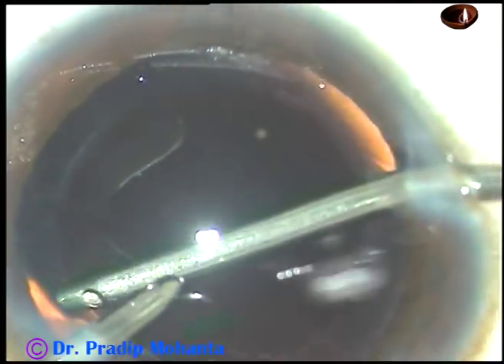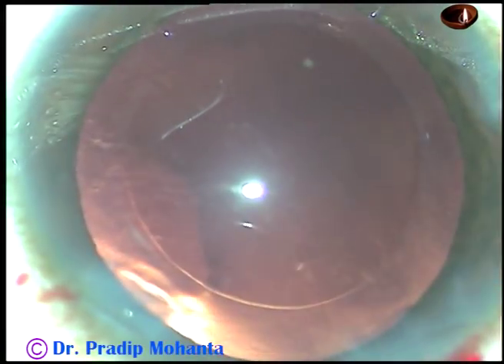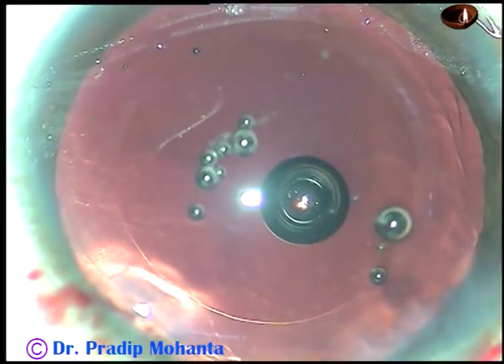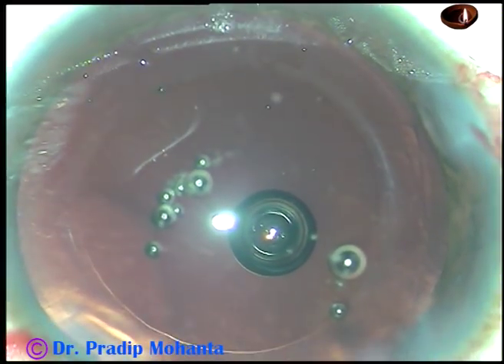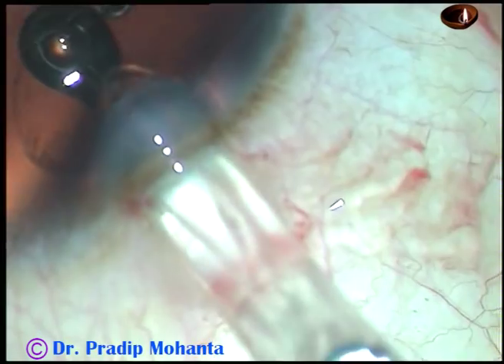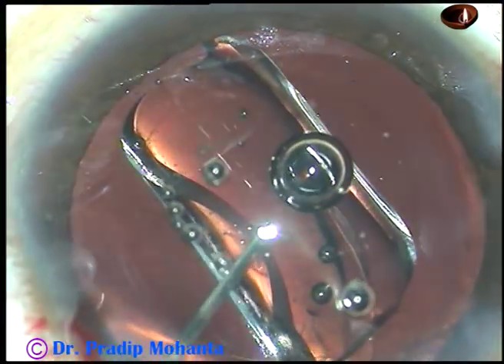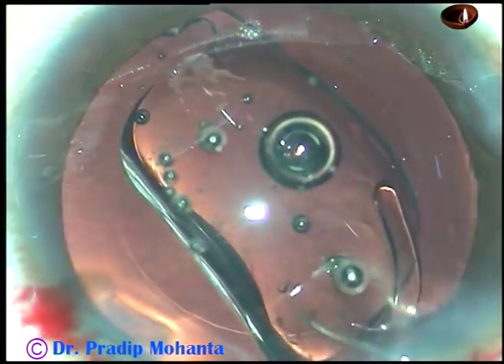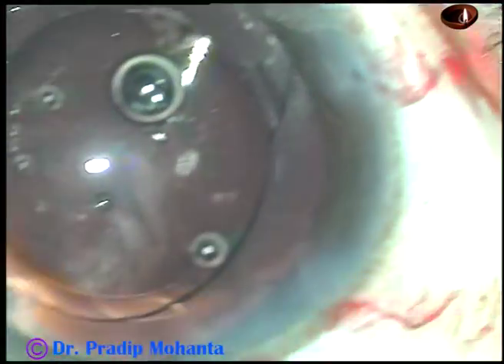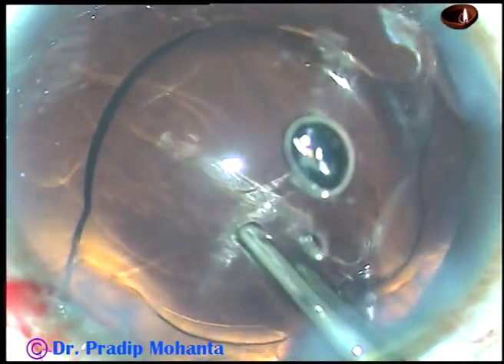In this case, we have selected a hydrophobic acrylic single-piece monofocal intraocular lens — the Tecnis single-piece — a beautiful lens with no glistening over many years of follow-up. The lens is being implanted via wound-assisted delivery; the main incision has not been enlarged. No financial interest, but I like this lens very much. I have implanted this lens in an eight-year-old boy with developmental cataract, followed up for more than six years — the lens is very clear, no glistening.